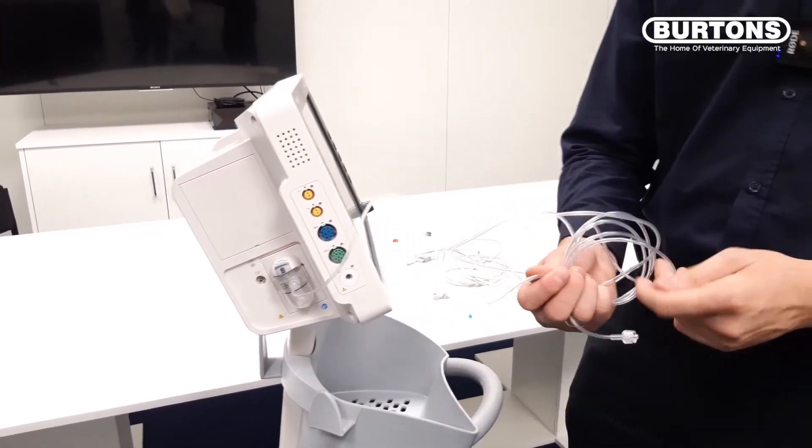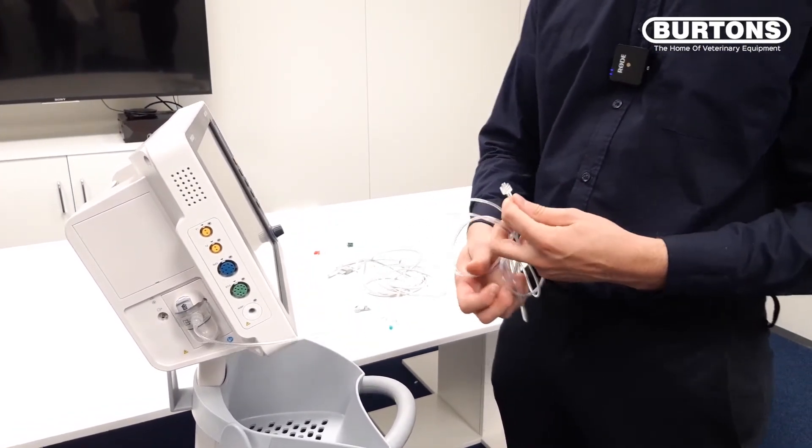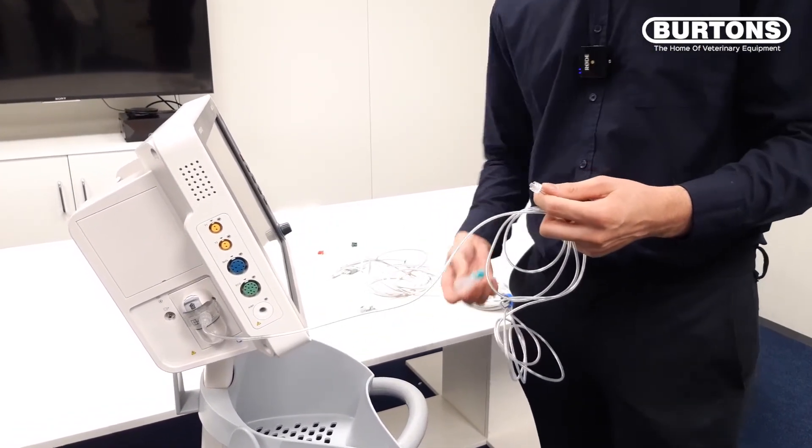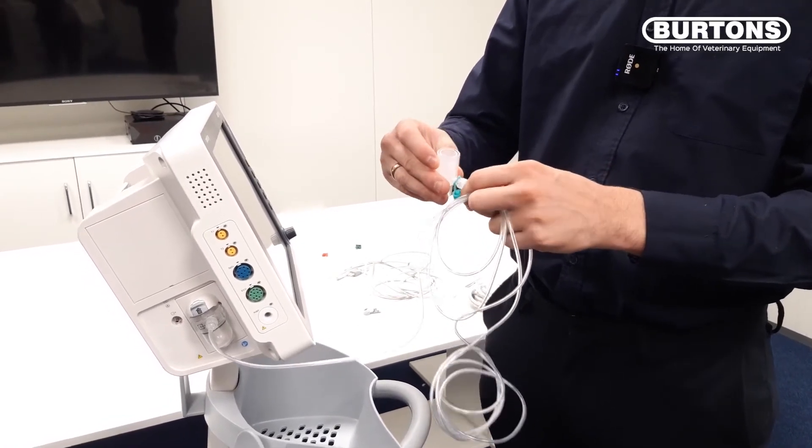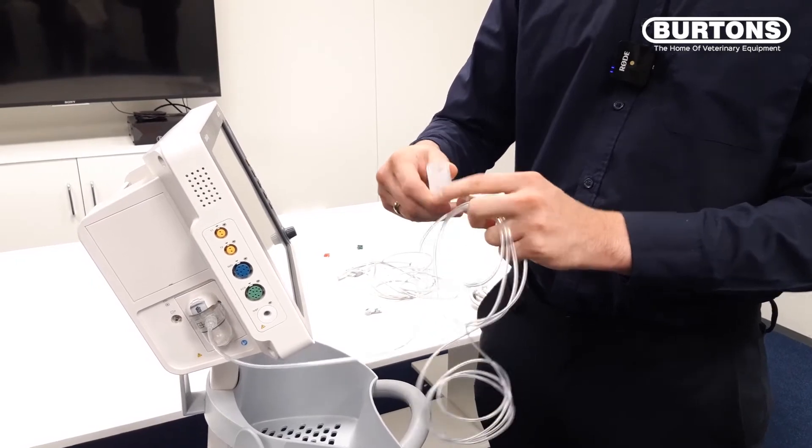On the other end of the sampling line you will see another luer lock connector, and this is where we attach our ET tube connector. So we push on there and twist the same way.